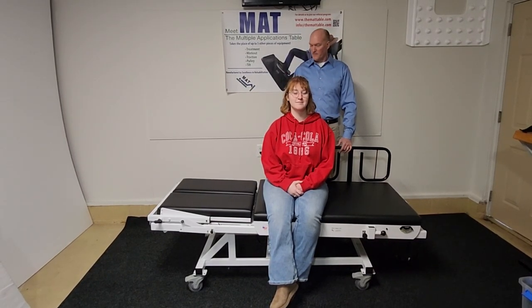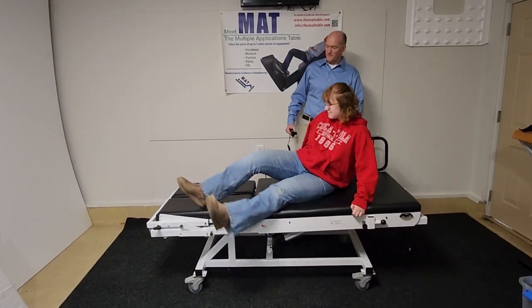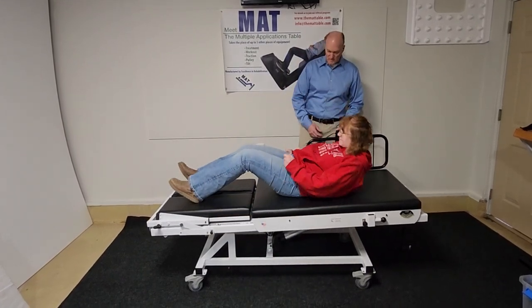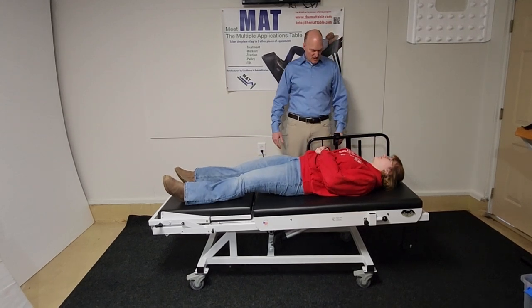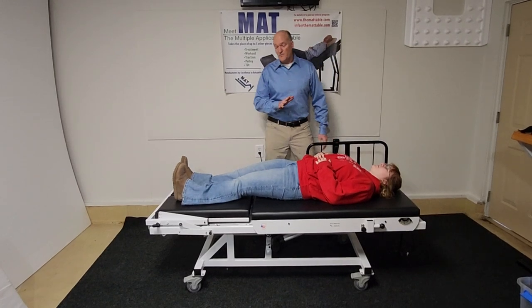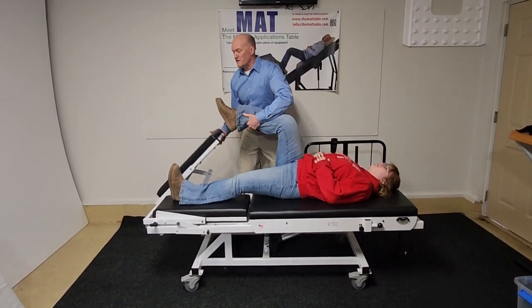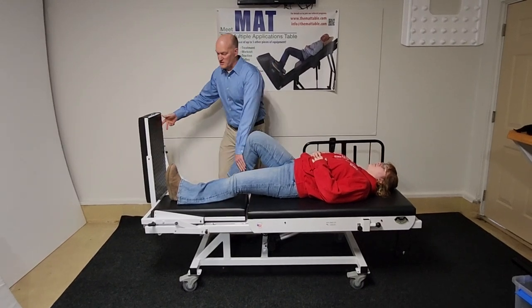Obviously you can use it for all the other things that you can use a table for. Let me have you laying right down here. So you can do whatever exercises you wish to do in whatever tilted position, and then without the patient ever leaving the table, you can very rapidly convert it into an exercise machine.